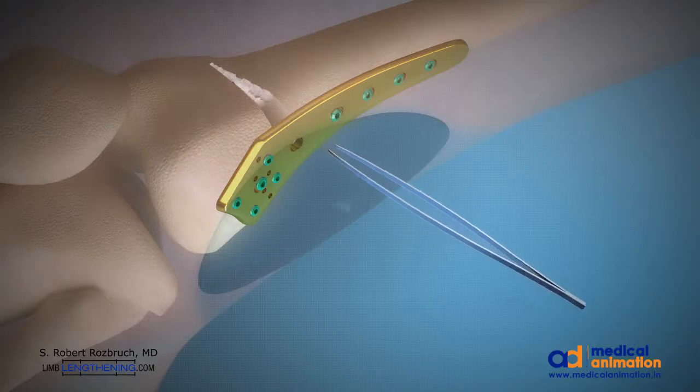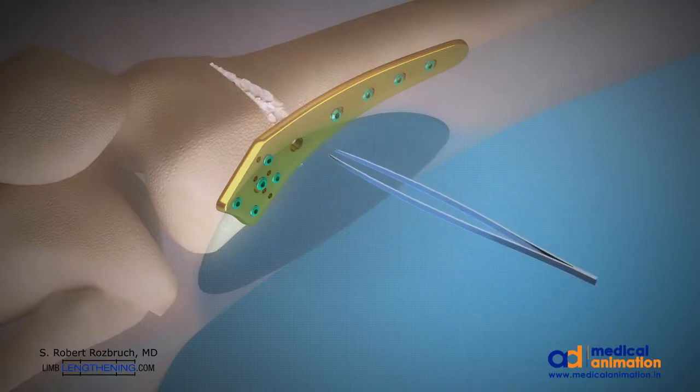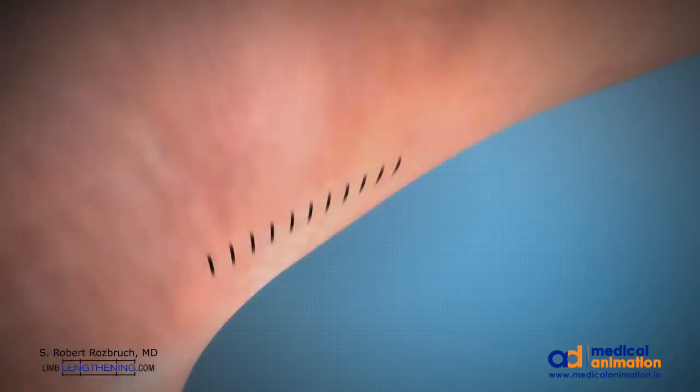We are also using tranexamic acid during this surgery to minimize blood loss. A drain is placed and the incision is closed in layers. An acute correction has been accomplished so the patient leaves the operating room with a straight leg — the hip-to-ankle line goes through the center of the knee.